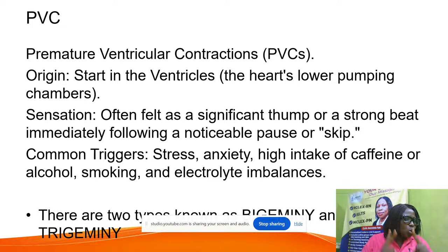Let me now ask us a question. Who among these two has a tendency for a higher occurrence of premature contraction? Is it bigeminy or trigeminy? Who among them? I'm expecting us to reply, please, so that I'll be sure you are following me and you are getting it.